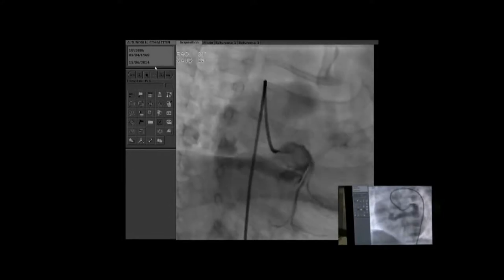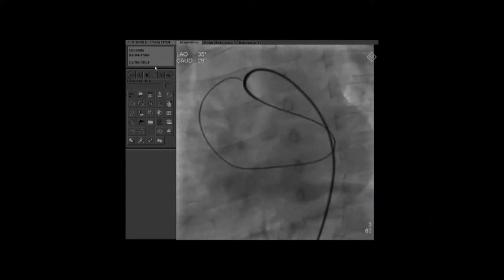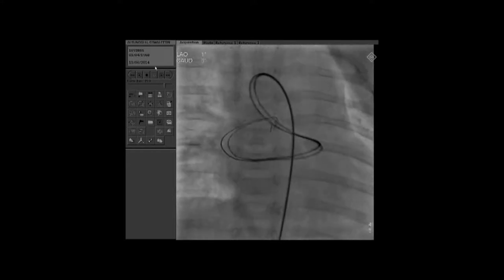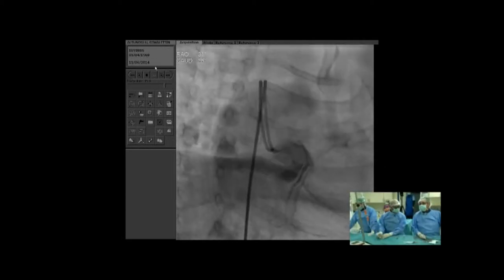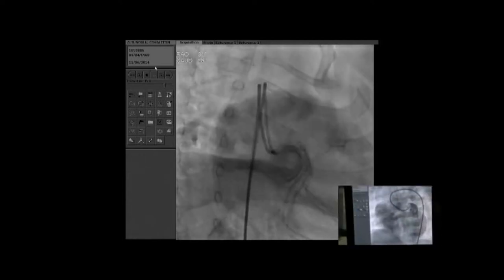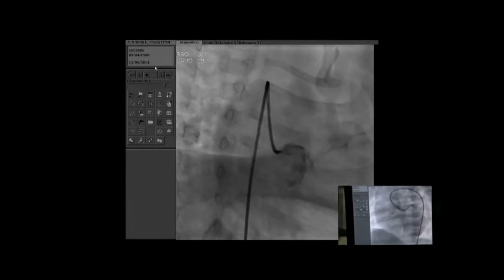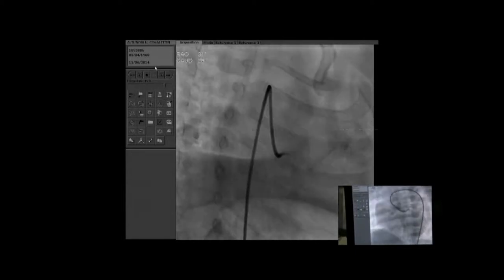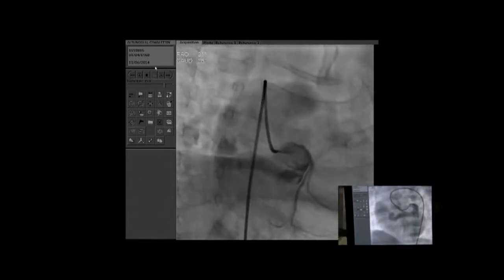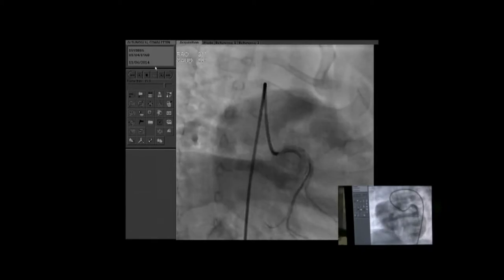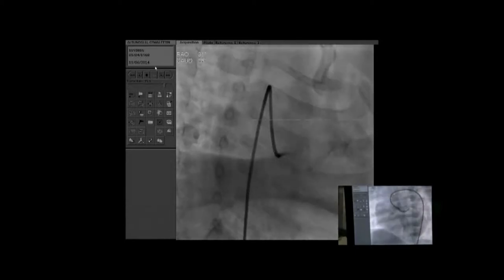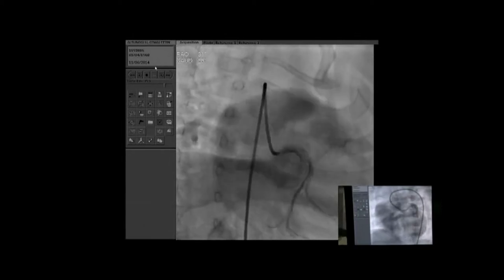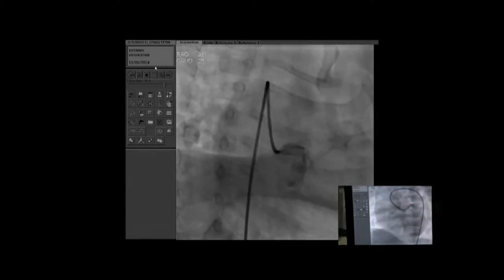We had a little bit of discussion here about what to use and what approach to take. The diameter — Ahmed, can you remember the diameters? Six millimeters at the middle part. So the vessel is around 6 mm in that mid portion towards the aneurysm, and further back towards the left coronary origin it's about 7 or 8 mm. Remember, this is a five-month-old, eight kilos. One of the discussions was how to close it and what to close it with. Any suggestions?